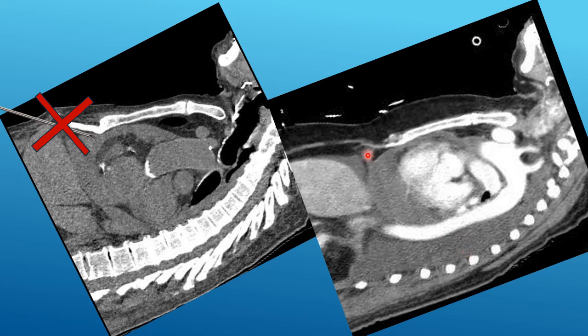How about an alternative? Lots of separation between the sternum and the liver. But here, if we take our 30-degree approach, you're actually going through a very narrow portion of the fluid. Actually, a steeper angle might be more appropriate in this example. This shows you how knowledge of the anatomy, gained principally with ultrasound, helps you to direct the procedure and not follow the basic rules.